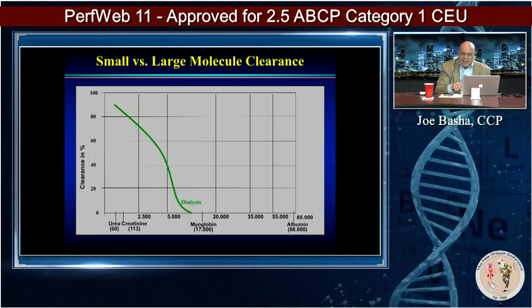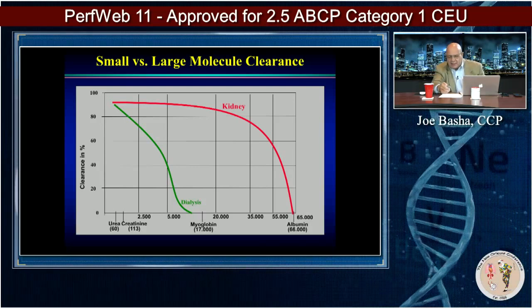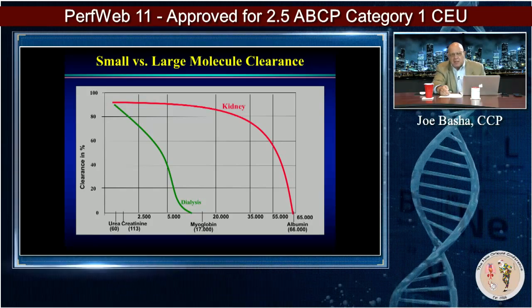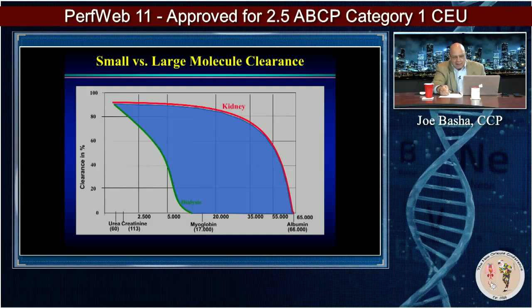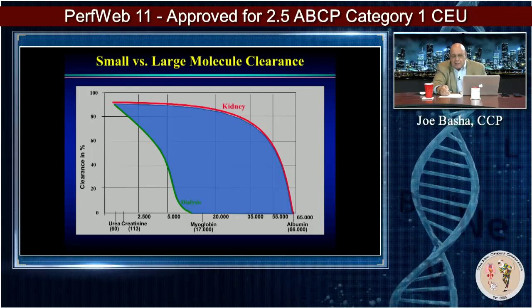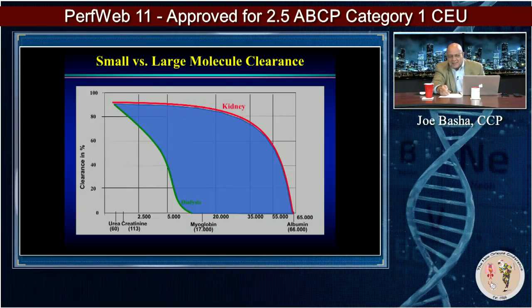But when you look at what the kidney normally does, you can see that its ability to remove molecules is much, much greater. It can remove much, much, much larger molecules. So all of this area that you see here in the blue essentially is an opportunity, an opportunity for a better technology, which we're here to discuss.